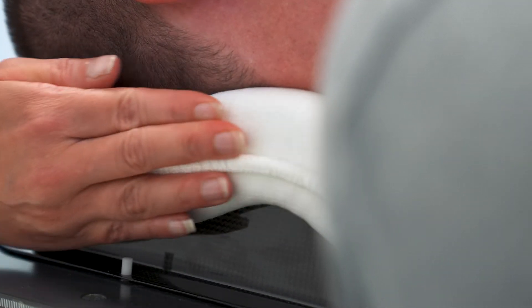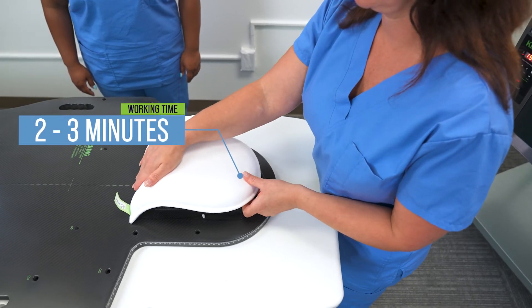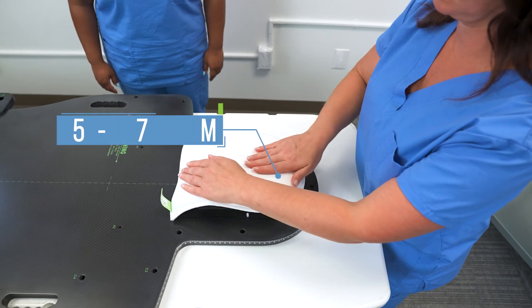You'll have two to three minutes of active working time, and the cushion will be fully rigid in five to seven minutes. Once the cushion is firm, you can go ahead and form the mask over top.